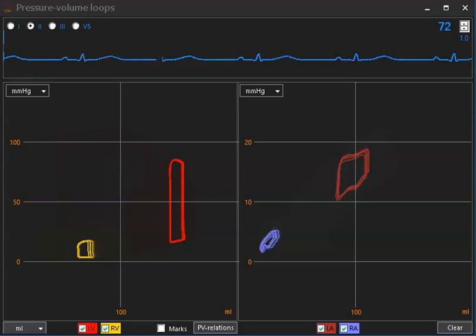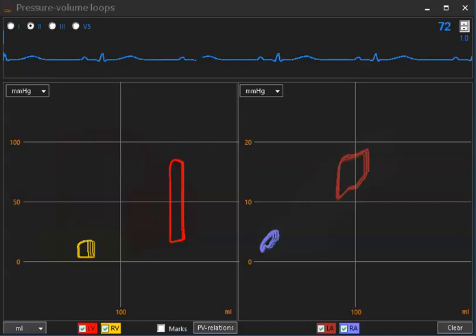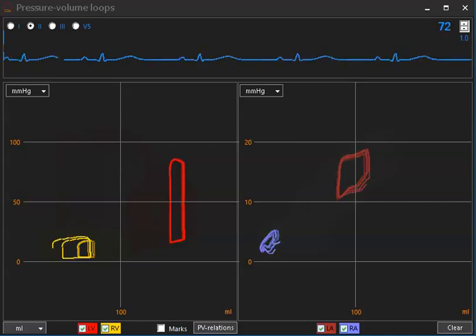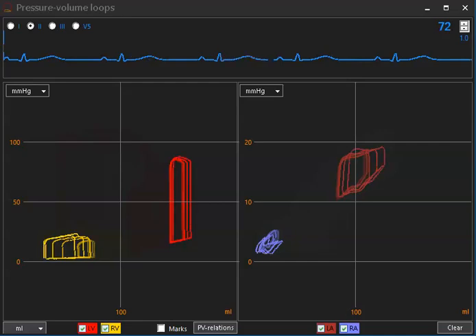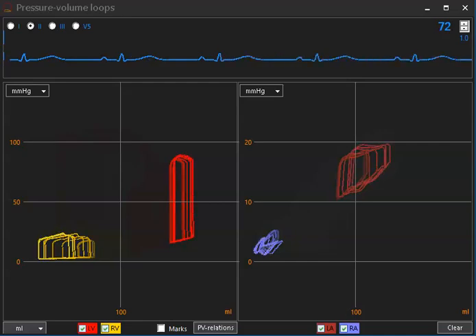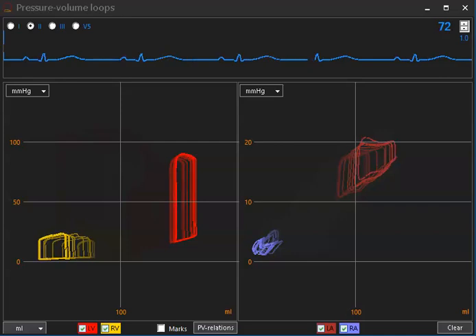But I now start to increase contractility. You see the yellow loop showing less dilatation of the right ventricle.